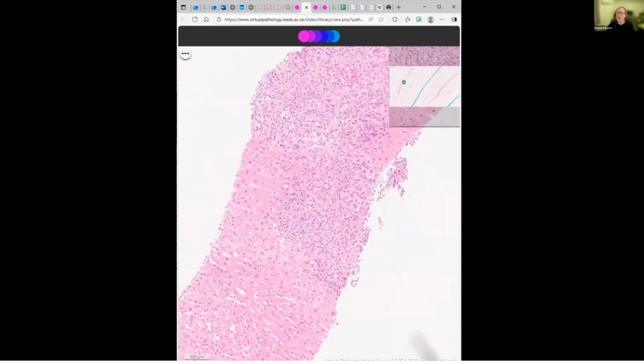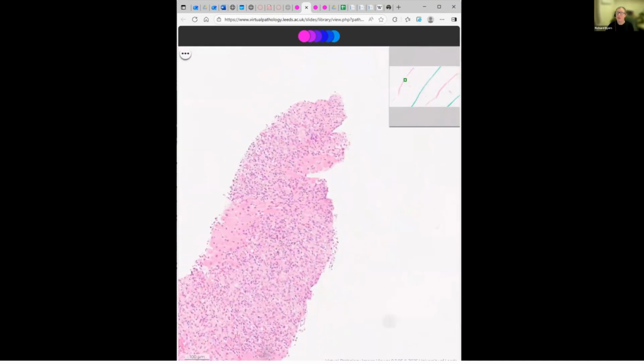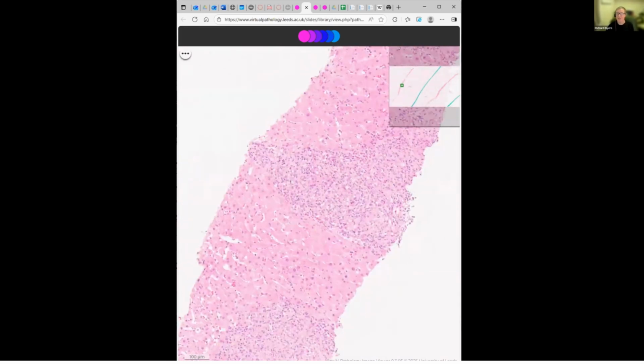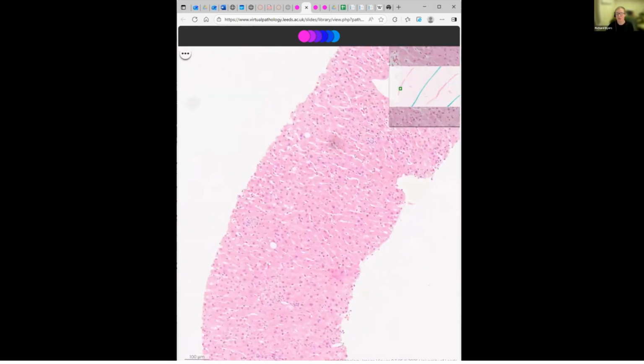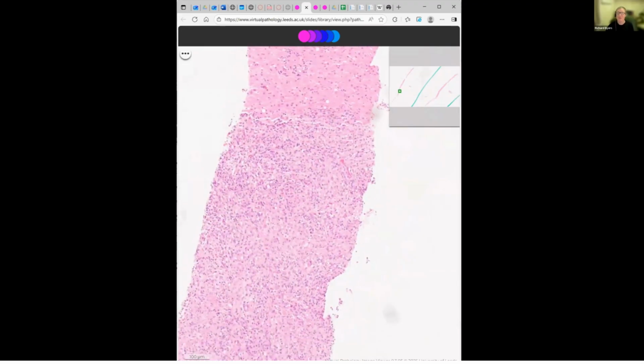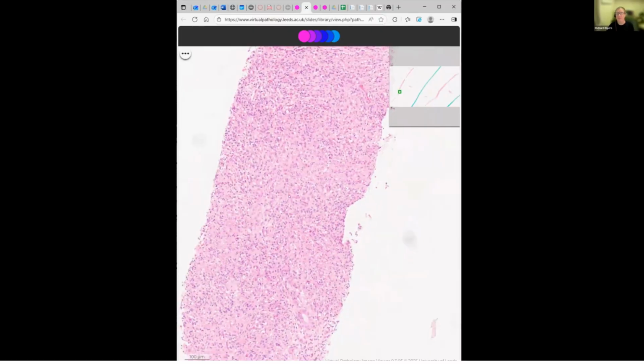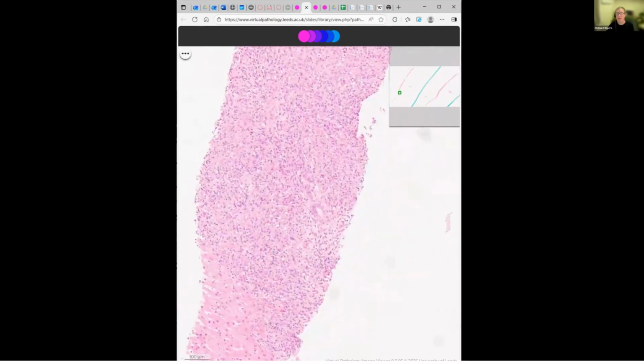So there are multiple nodules spread through the liver. They don't look like carcinoma. Of course, this is a lymphoma EQA, so you wouldn't expect it to be carcinoma. So we're expecting a hematological condition, and it may be either reactive or neoplastic in the EQA.